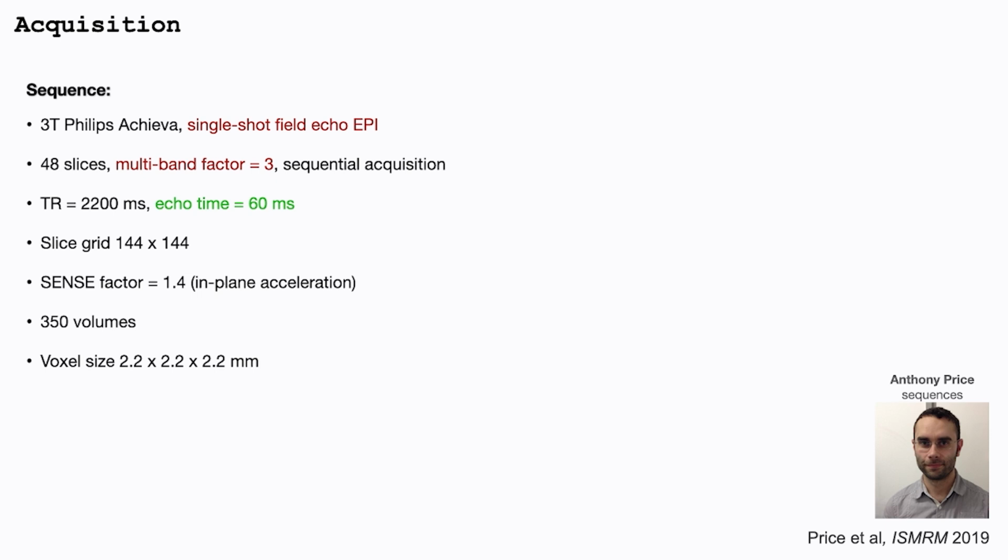In order to acquire data in this high motion regime, you need to implement fast acquisition sequences. That's why we use a single-shot gradient echo sequence and multi-band acceleration. However, there are certain constraints on how quick you can go. Particularly, T2* is longer in an immature brain, which means you would perhaps need longer echo times, and the longer echo time also helps to suppress the fat signal in this data.